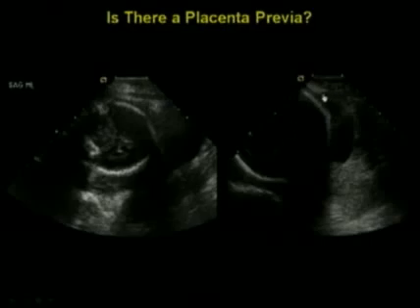Similarly in this case, this is a sagittal view low. There's the baby's head, a little bit of amniotic fluid. You can see part of the cervix, part of it is shadowed. We just can't see things well enough to decide whether or not there's a previa. So what do we do? Do we send the patient away and report that we can't tell? Well, again, that wouldn't be doing anybody any good. But fortunately, there are things that we can do to get an answer.